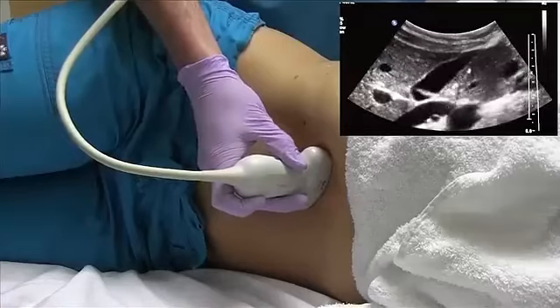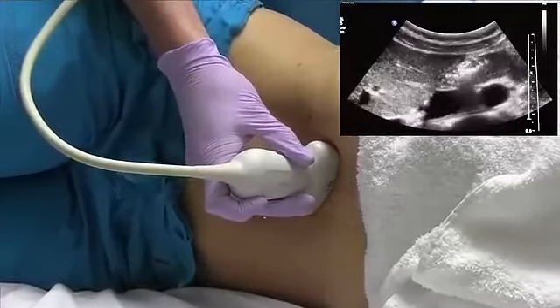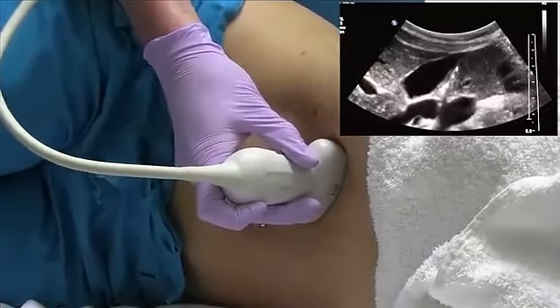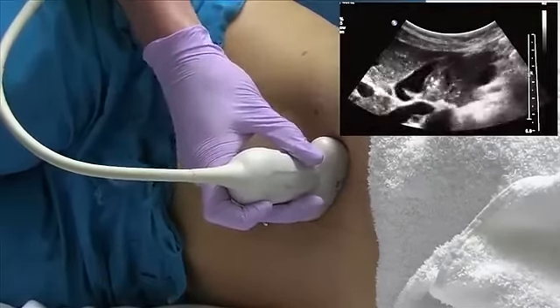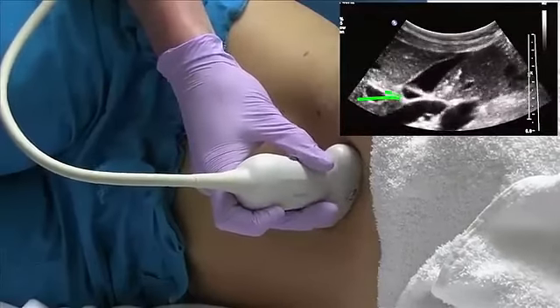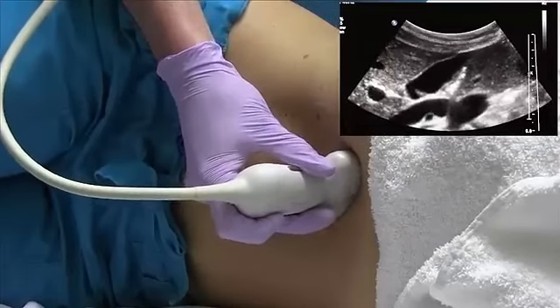You want to sweep through the gallbladder, and if there are any stones, they should drop into the fundus of the gallbladder from this plane. This is also good for opening up the neck of the gallbladder to make sure there are no stones impacted in the neck.